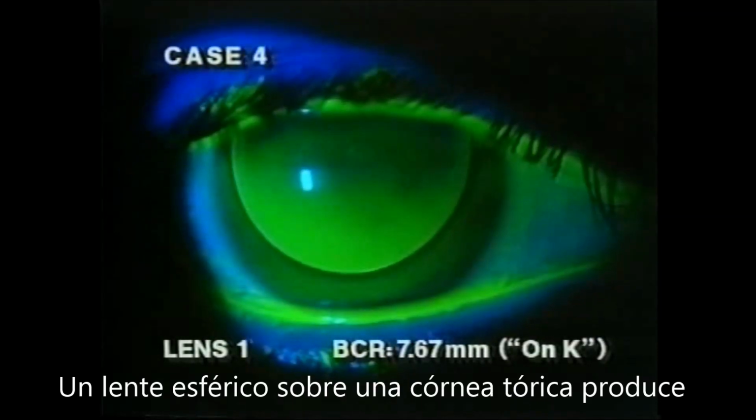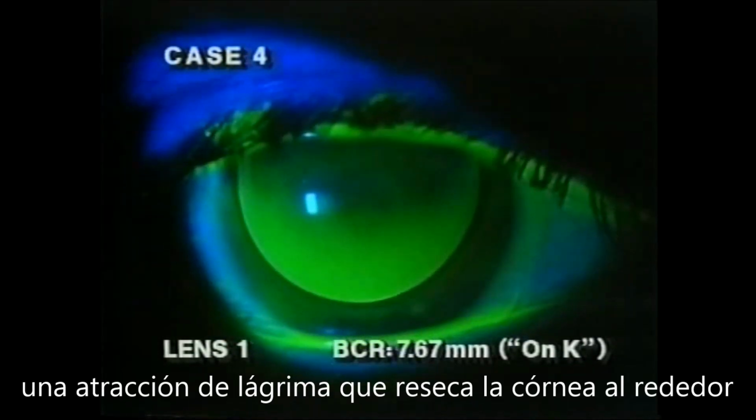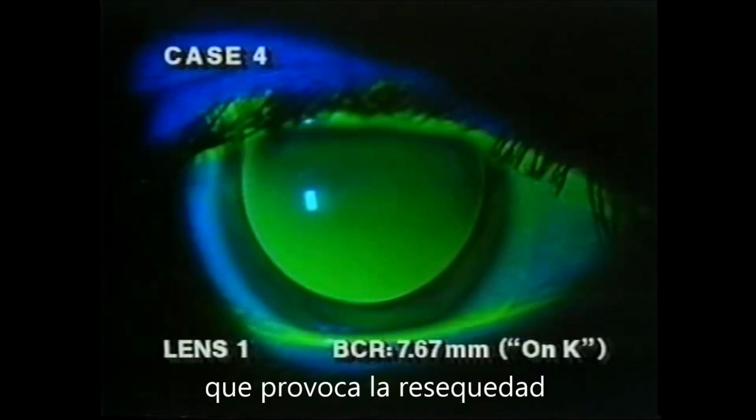A spherical lens fit on a high astigmat may cause subjective lens awareness. There may also be clinical signs of corneal staining and distortion resulting from the lens rocking with the blink.